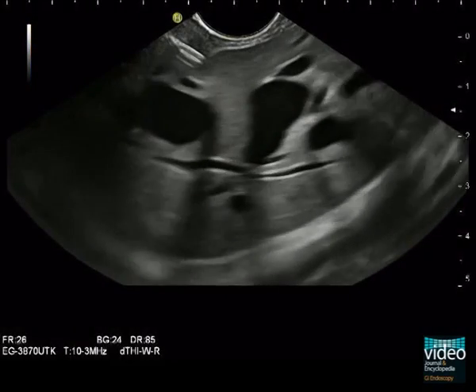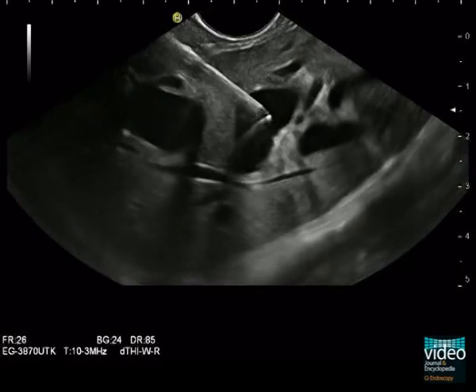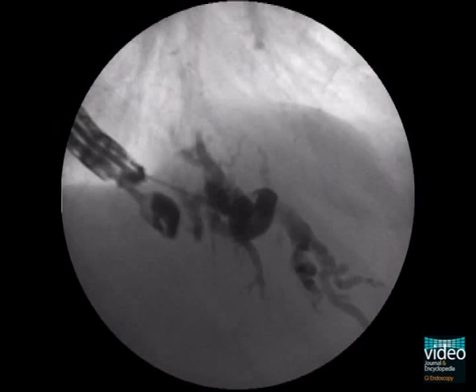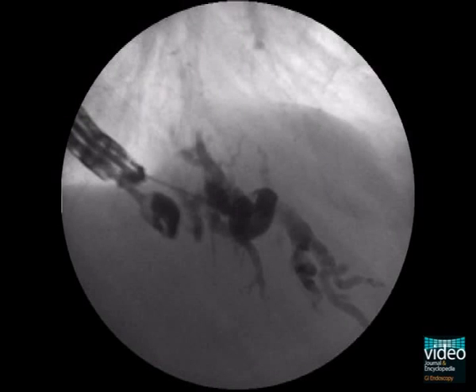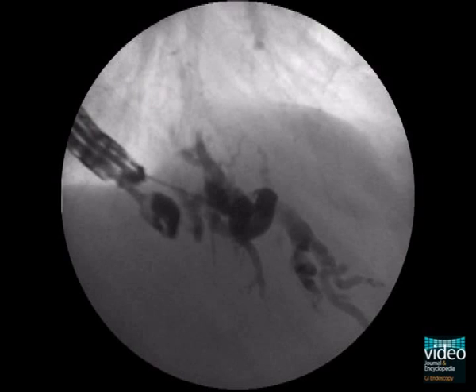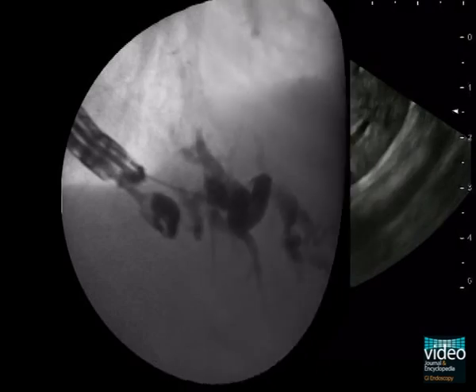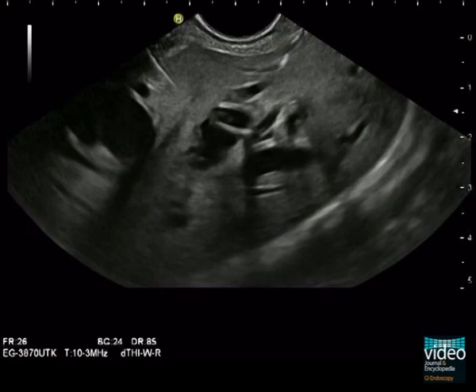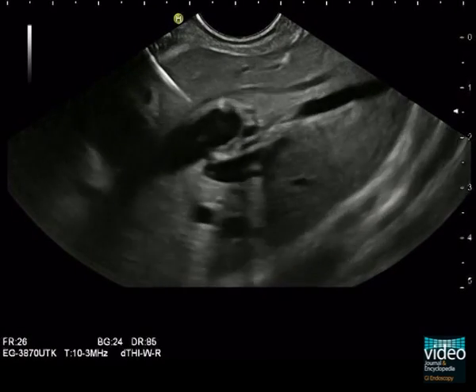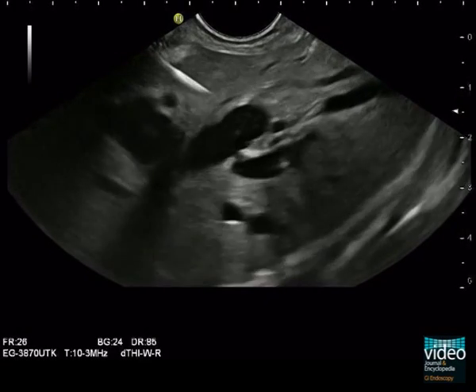The transgastric puncture of the left hepatic duct is performed with a 19-gauge needle. Using contrast media, control fluoroscopy confirms the dilated intrahepatic bile ducts and the absent bile drainage through the anastomosis into the jejunum. Under EUS guidance, a 0.035-inch guide wire is inserted through the needle into a bile duct.